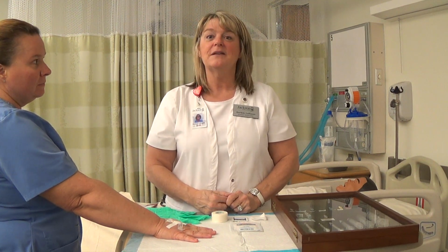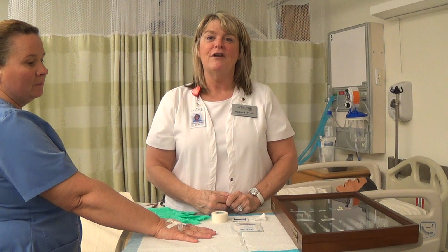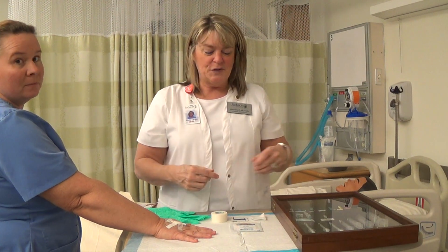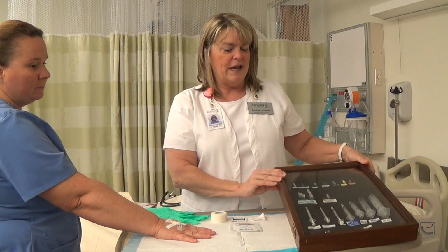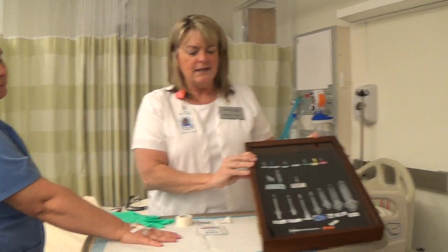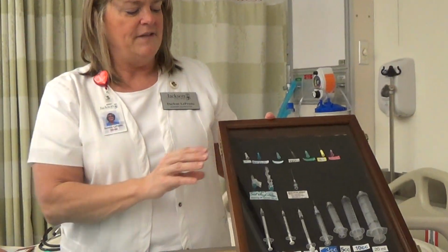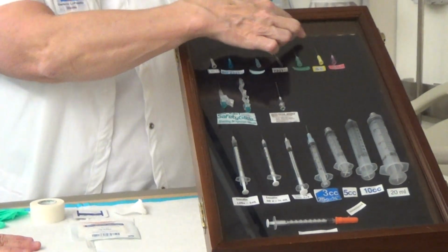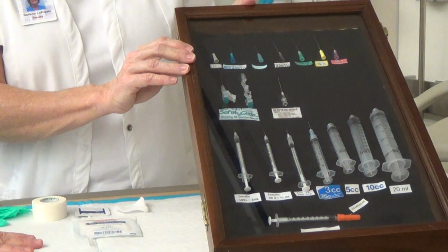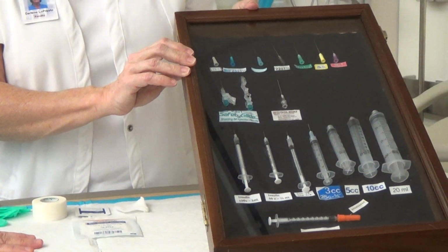Today we're going to talk about discontinuing a peripheral IV site. So we have our model here, but let's first take a look at this shadow box. Peripheral IV sites are used for IV administration, and you'll learn more about that in pharmacology. And these different colors represent all the different sizes of IVs that we have.